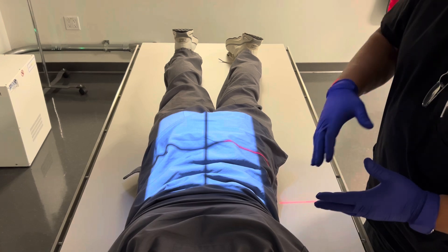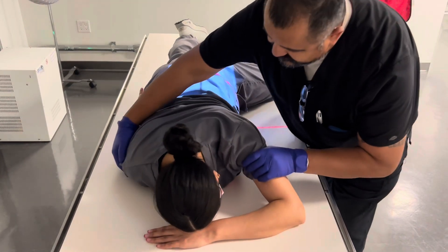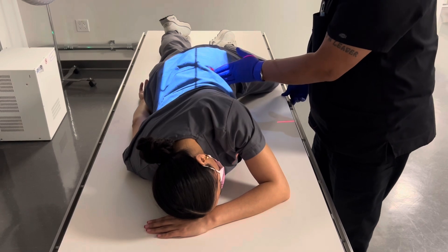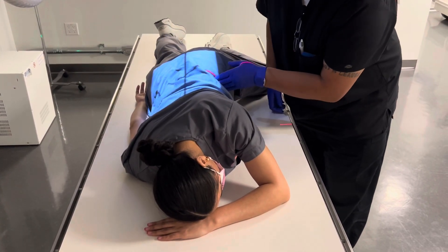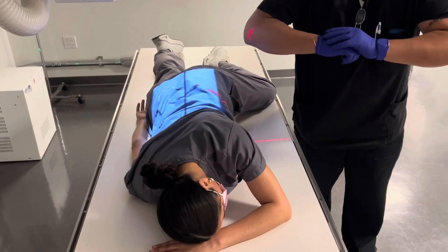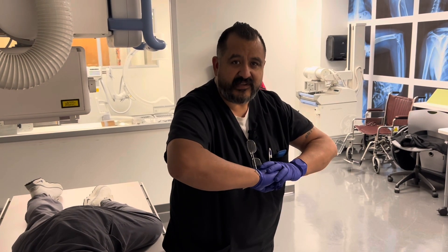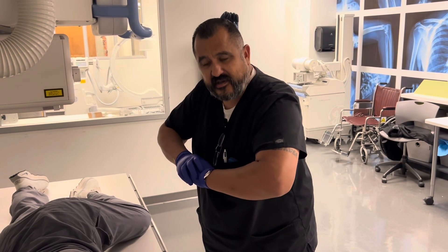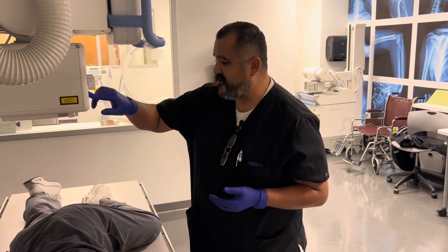Now we're going to transition into the RAO position. Put this arm down, bend this knee, and rotate the shoulder — we're at about 45 degrees; the range is 35 to 45 degrees. Center right on the iliac crest, two inches from the spinal column. In the RAO, you're going to see the right colic flexure. Think of the colic flexures like elbows — to see the right colic flexure you turn into the RAO. For the left colic flexure you use the LAO. If you can't do an RAO you can substitute an LPO, and if you can't do an LAO you can do an RPO.